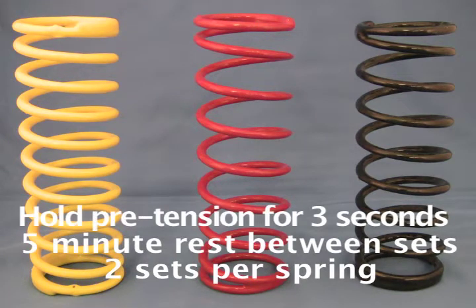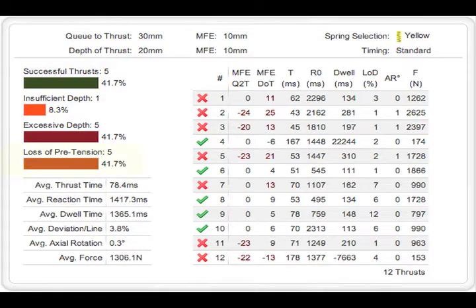seconds with each thrust. As you see, the student has difficulty holding the pre-manipulative tension prior to the thrust. The student is releasing tension just prior to the thrust, essentially bouncing off the patient. As you know, this is one of the most common problems seen with beginners. We see that the student demonstrates very little control over the depth of the thrust and wavers from a straight line of drive more and more as the spring tension is increased.